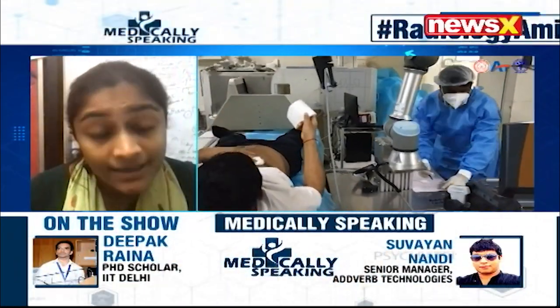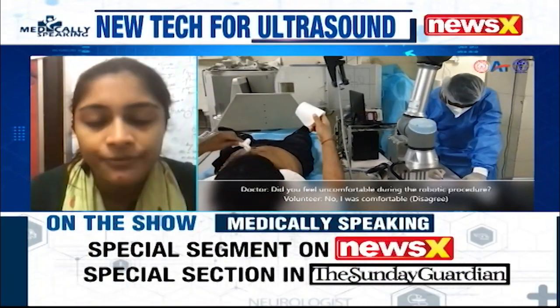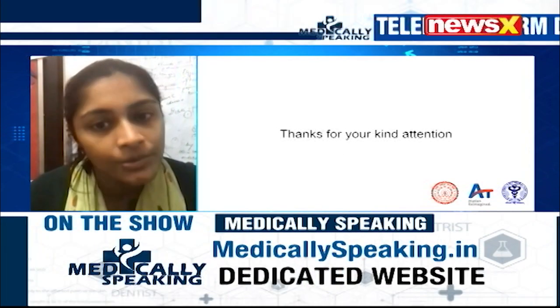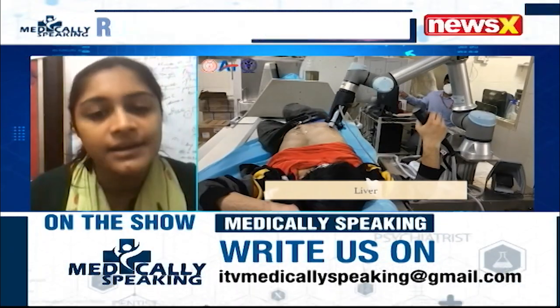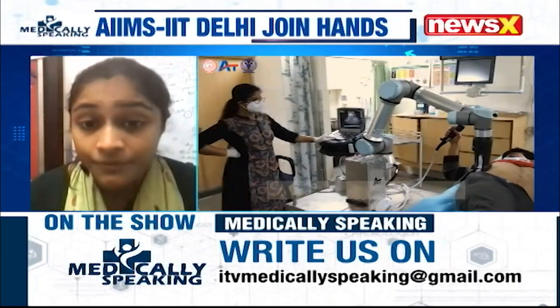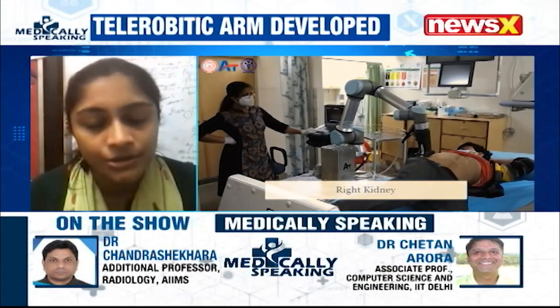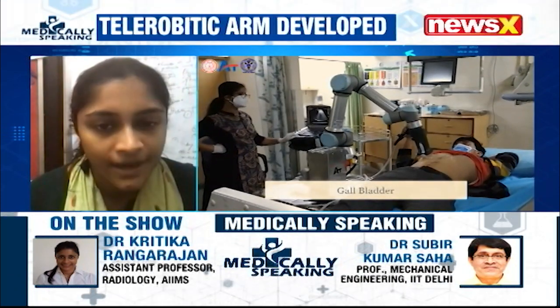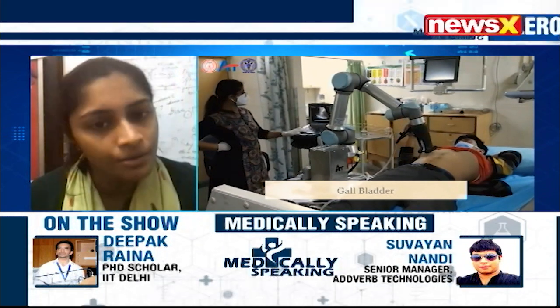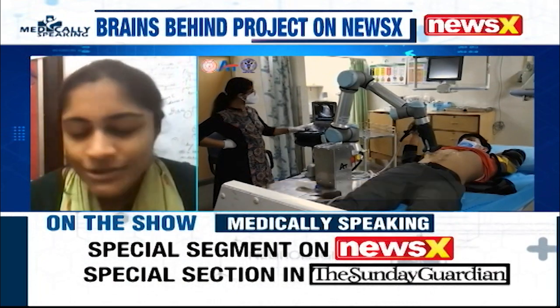And like you said, we are testing it clinically currently. Our first set of clinical tests were not actually performed on patients. These are just performed on normal individuals, where through extensive clinical tests we will first ensure that there is no difference. I think you mentioned it very correctly. The first step is to ensure that there is no difference at all between the kind of ultrasound and the kind of diagnosis that we can get from a handheld ultrasound probe or from a robotic ultrasound.